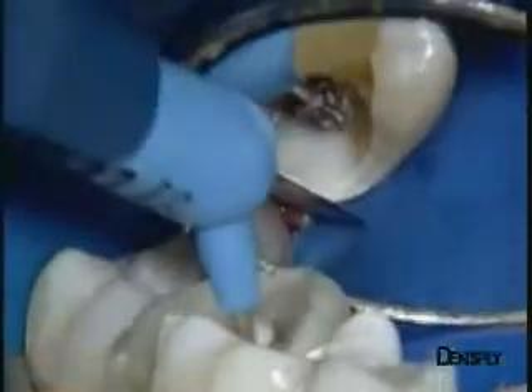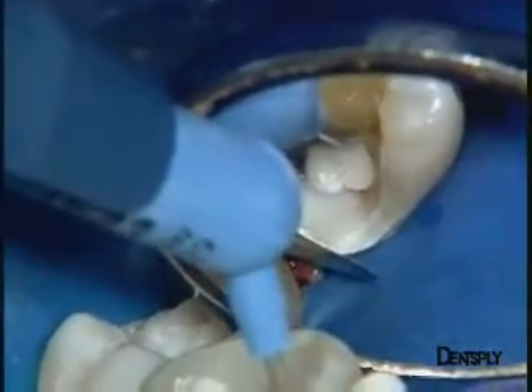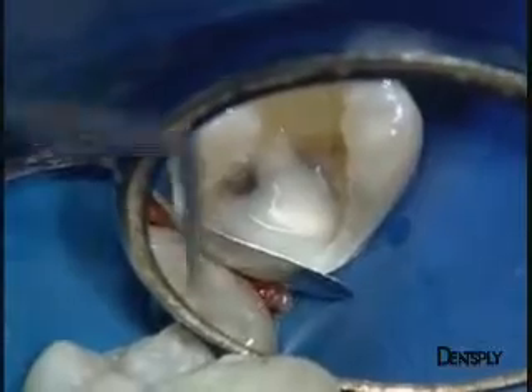A second layer of X-Flow will then mask all the distinctively coloured dentine. It's known that these flowable composites with lower elasticity modulus than the microhybrid composites improve the seal and the marginal integrity of restorations.